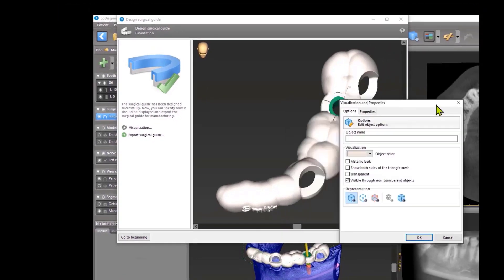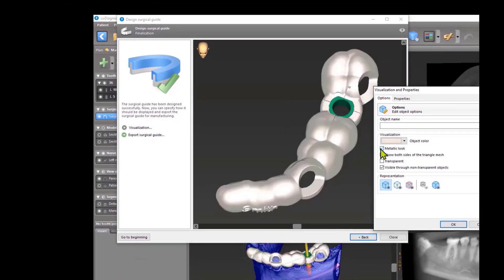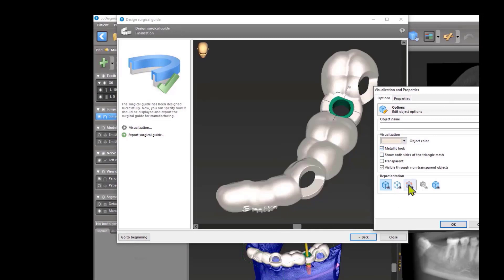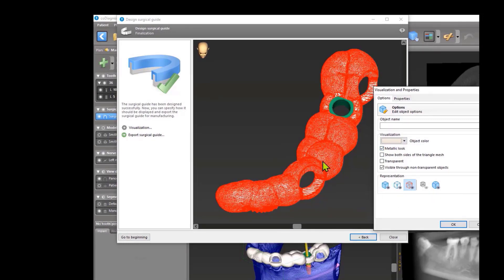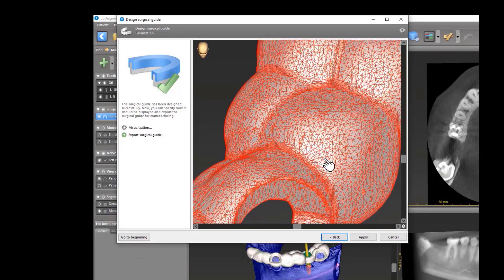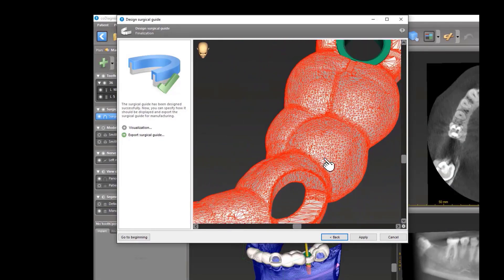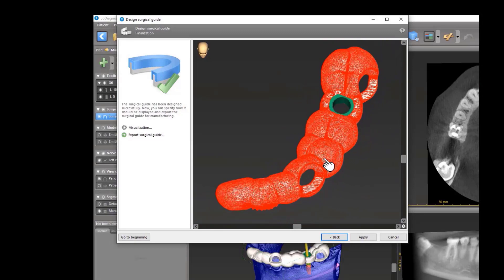For example, you can give your guide a metallic look, or you can activate it here to see the number of triangles and how it is calculated, just to know what is an STL file.